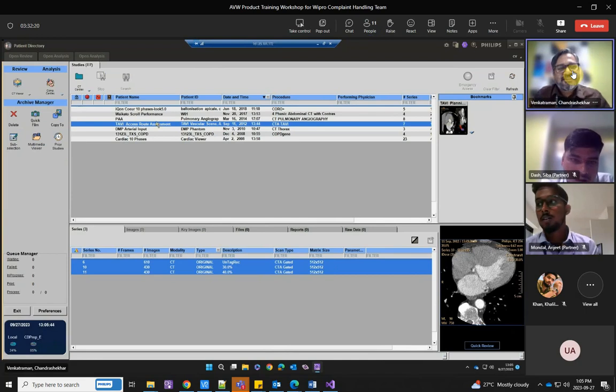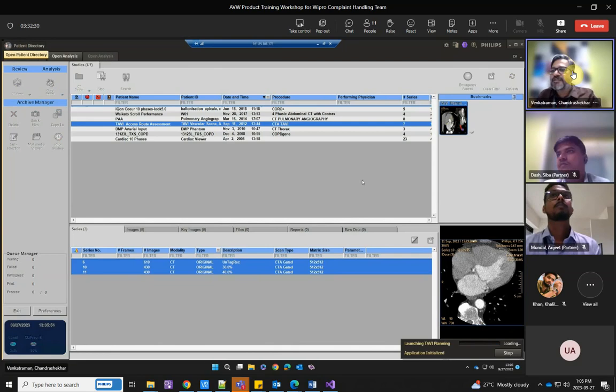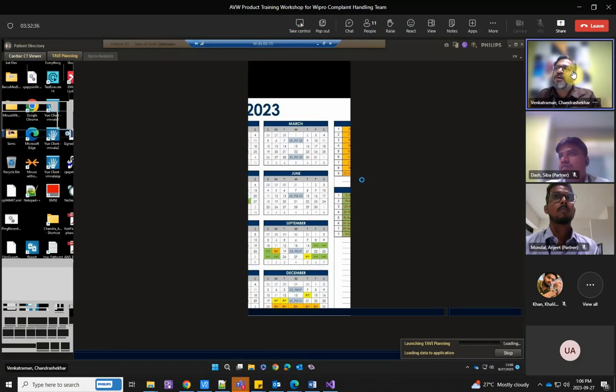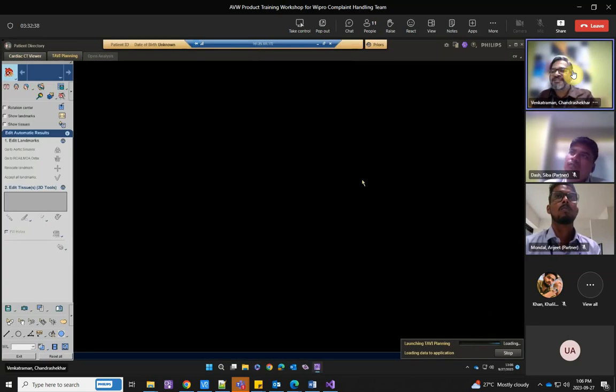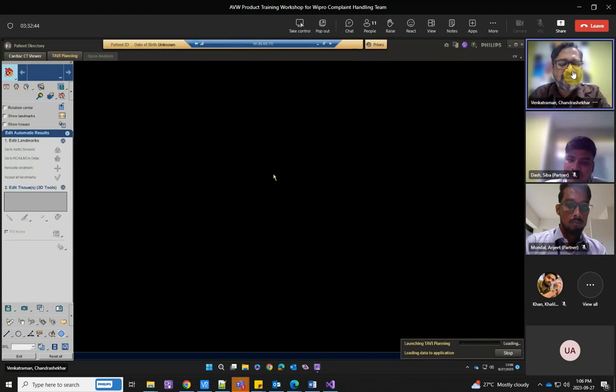So this application is actually used where stent placing is done across so many vessels, not only for the heart, even for angioplasty and all that. It's done even at the legs and where not. TAVI is more for the aortic valve. Aorta, you know where it is.